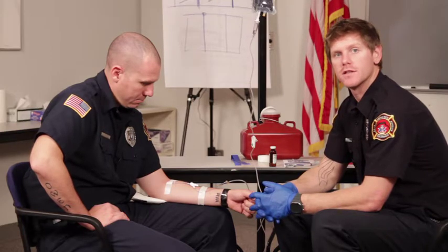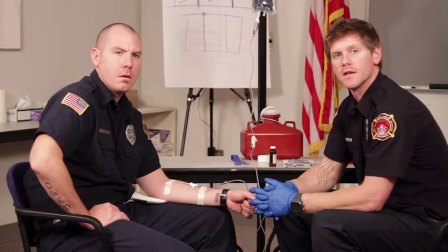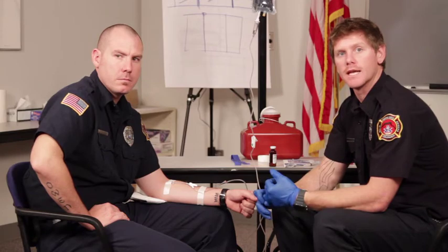We've already established the IV in this patient, so we want to make sure to continue to wear our body substance isolation precautions. We also want to ask a few questions to our patient — we want to make sure they don't have any allergies and that they have the appropriate indications for the drug that we are administering.